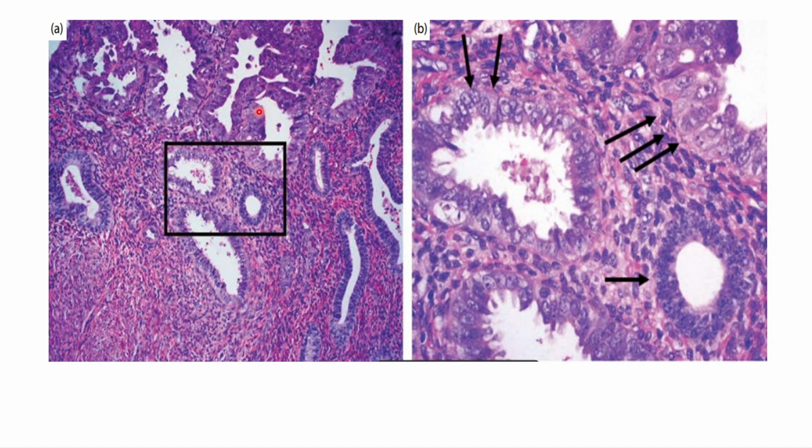Now in this section we can see three types of glandular morphology. So these are the atrophic glands, right? These show mild to moderate atypia with high NC ratio, and these are the highly atypical glands showing papillary tuft formation in a few of the glands.